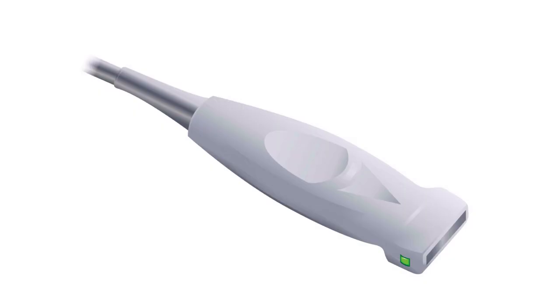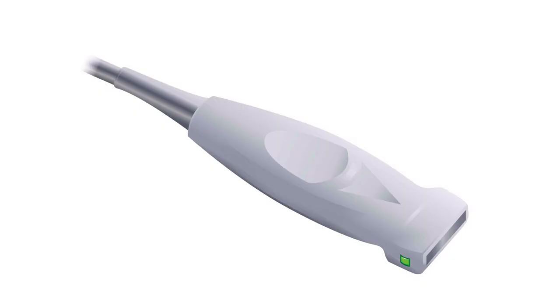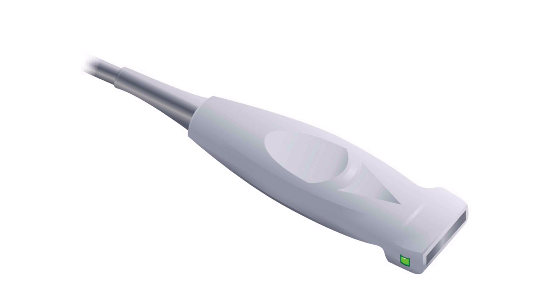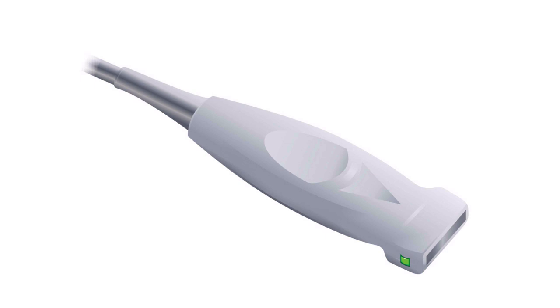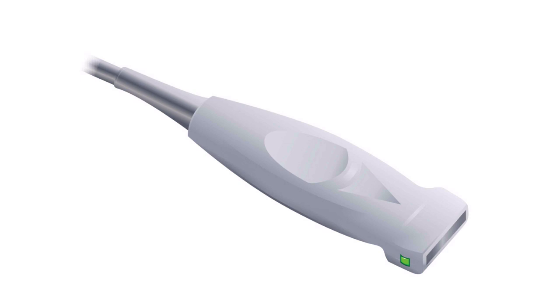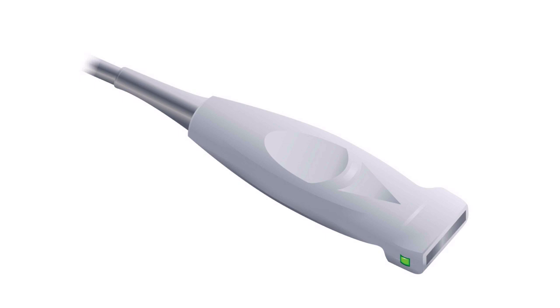Welcome. This is going to be a video lecture discussing ultrasound-guided peripheral vascular access. The probe we're going to be using is the linear array probe. This will offer a high-resolution, high-frequency image for good localization of the vascular structures and the needle during the procedure.